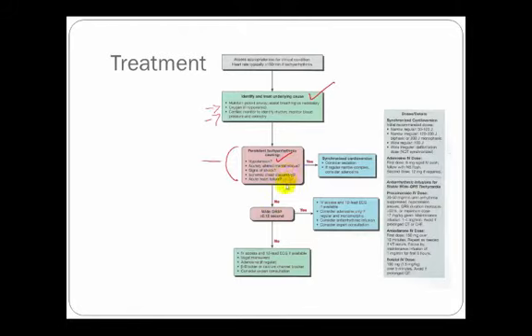If any of these are present, or a multitude of these are present, again, hypotension being our number 1 method of determining instability, then we need to synchronize cardiovert our patient. Consider sedation. If there's not enough time for that, better bad dreams than no dreams at all. We're going to shock in a pattern of, if we're using a physio-control model, 100, 200, 300, and then 360.